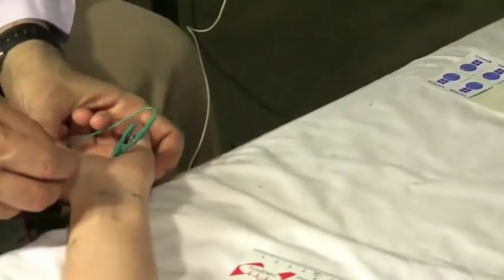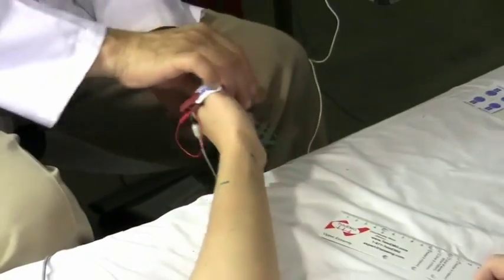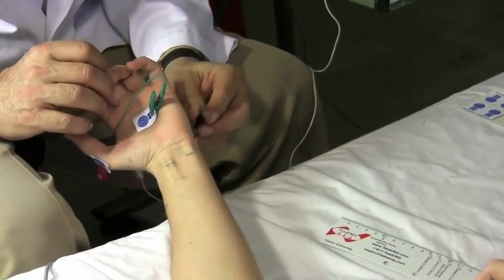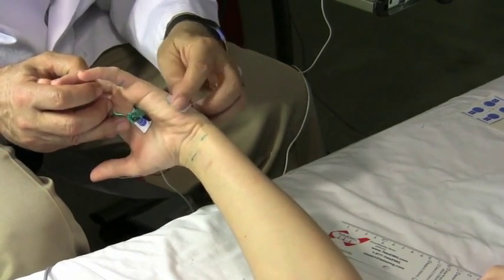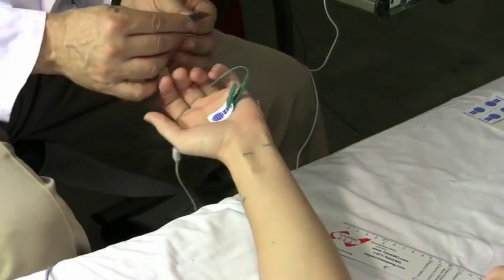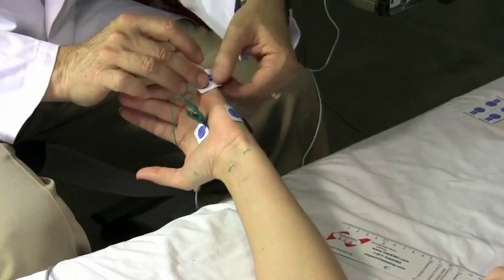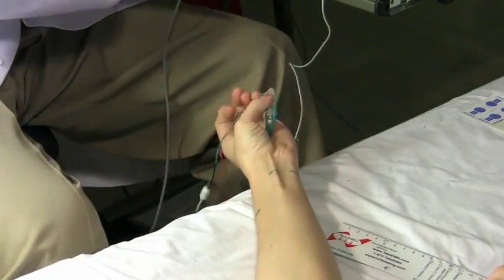I'm going to take these off here. Again, I'm still using the same electrodes. They have enough glue on them. I put it right where I marked up the spot. Okay, and I take this off and I put it on the baby finger, and I'm going to stimulate the ulnar nerve at the wrist.